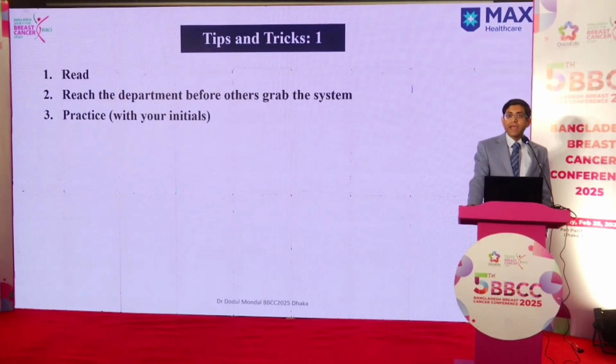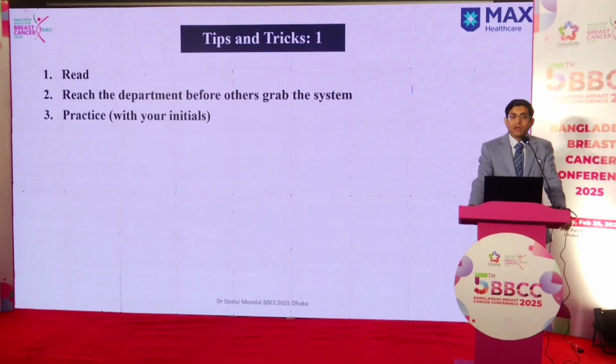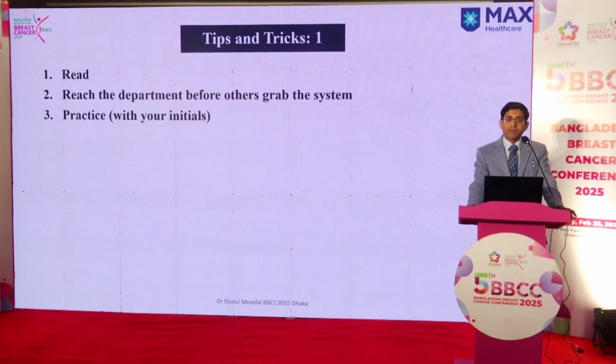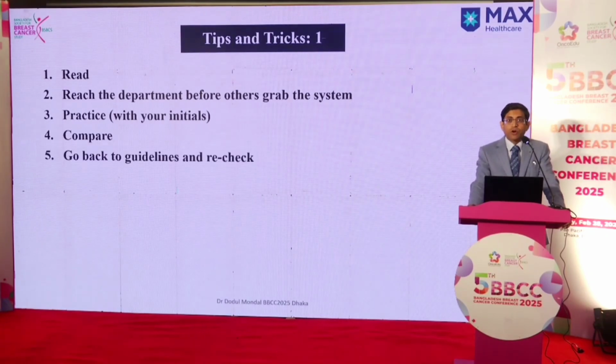And that actually helped a lot, because even before my senior checked, I had contoured it, and I verified the corrections he made and the difference between the corrected contouring and my contouring. So that always gives a lot of understanding. You must compare your contouring with your senior or whoever is in charge when they correct it. Note the changes, whether your contouring is significantly different or not.